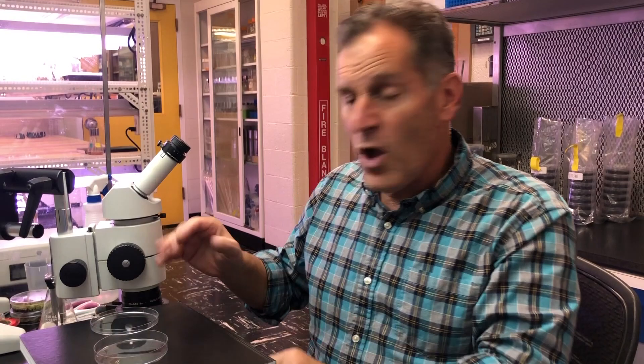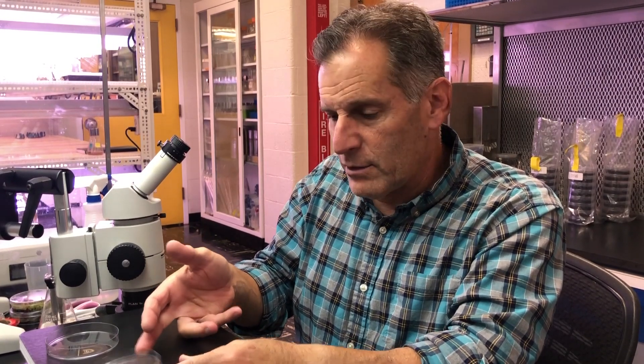I've seen people turn their lid upside down. If you're very careful, you can turn the dish lid upside down and set it over here. When you pick it up, you pick it up carefully like this. If you reach over to the lid to pick it up before you put it back on — guess what? You're reaching over your open dish. Even though it's just the lid, it's still an open dish. So if you turn the lid upside down, pick it up like this, turn it over, and then you're safe.